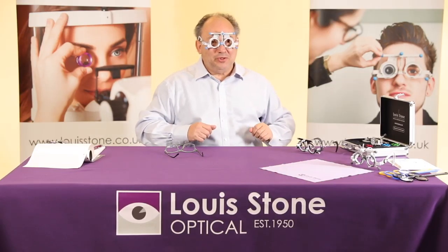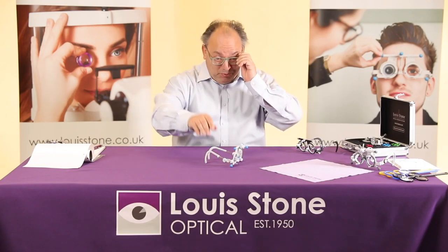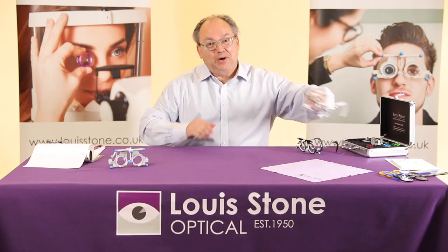I shall put it on for you so you can see how it fits. I've got a fitting model in the background who looks better than I do, but there we go. Right, so that's the UB4 — I'll put that to the side and show you the next one.